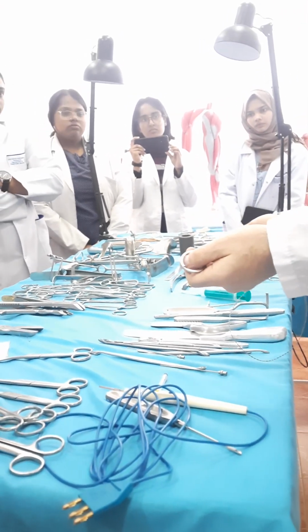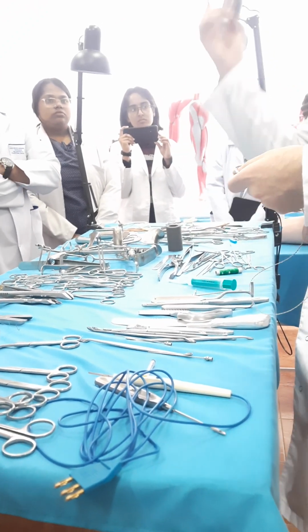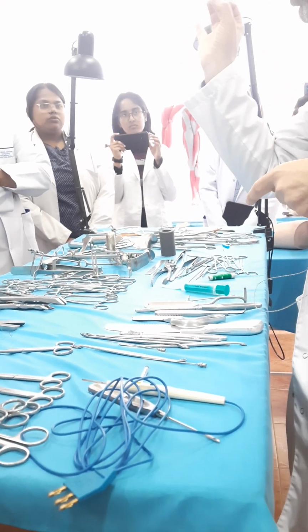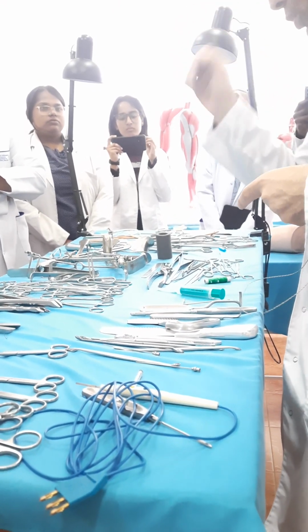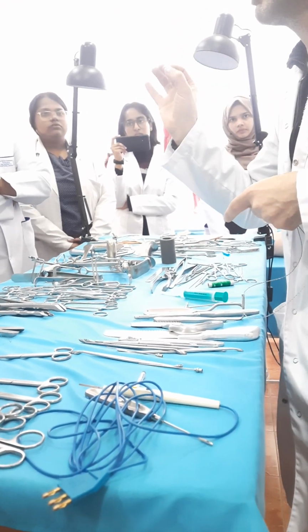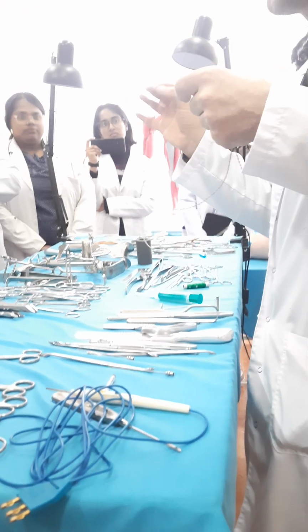I don't put the drill here because it's huge. We have electrical drills, we have hand drills. There are two types of tips for the drill, with a sharp point and with a ball-shaped form. The sharp-pointed one we use only to perforate the external compact layer. How do we understand that we are still inside the external white piece of the bone?